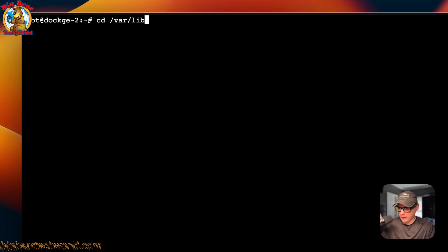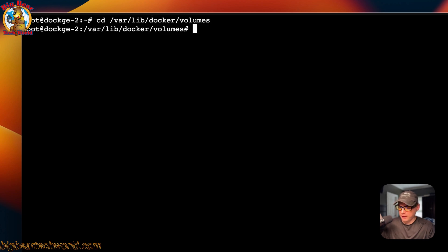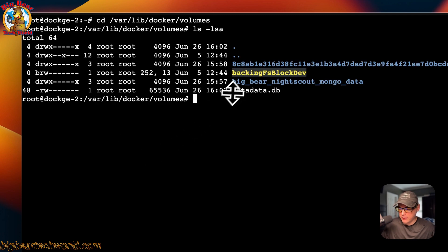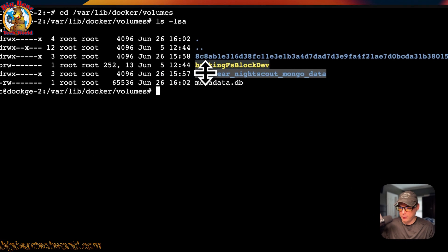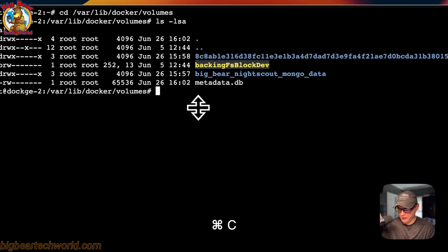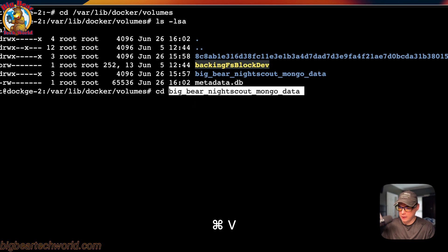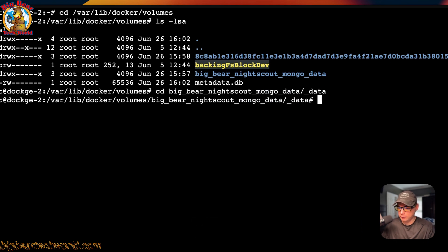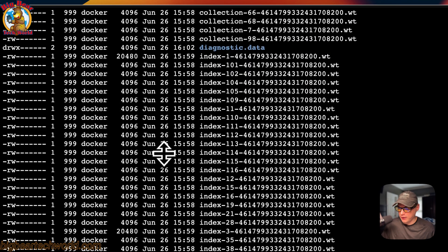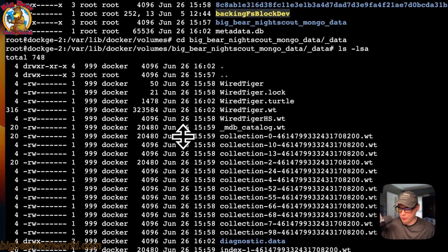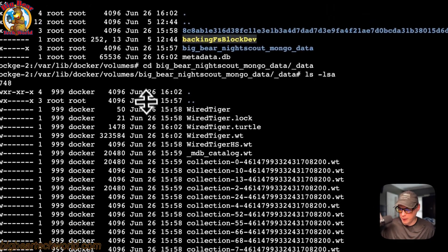Now I'm SSH'd into my Dockge server to show you where the files are located. I'll run 'cd /var/lib/docker/volumes' and then 'ls' — you can see 'big_bear_nightscout_mongo_data' right here. I'm going to cd into it and also go into the data directory. Running 'ls' again, you can see all the Big Bear Nightscout MongoDB data files right here — that's where your files are located.